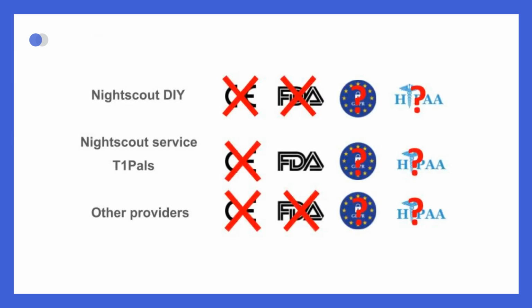Nightscout and its associated services are not FDA approved, except for T1Pals service. There is no approval from European authorities, so its use is on your own risk. Nightscout appears to be GDPR and HIPAA compliant, but does not claim official compliance due to the absence of auditors.